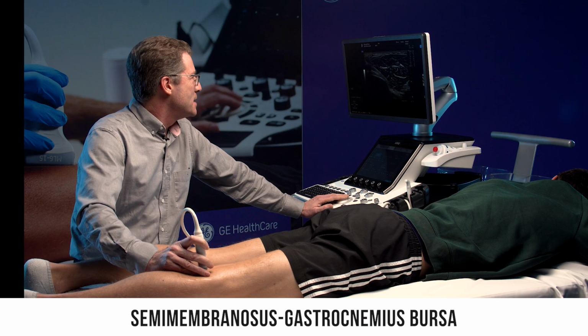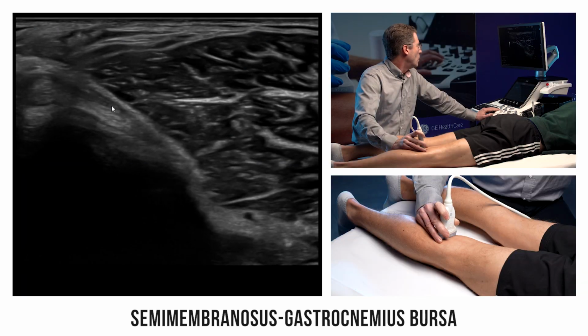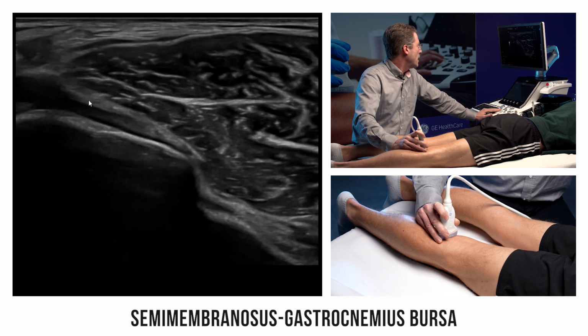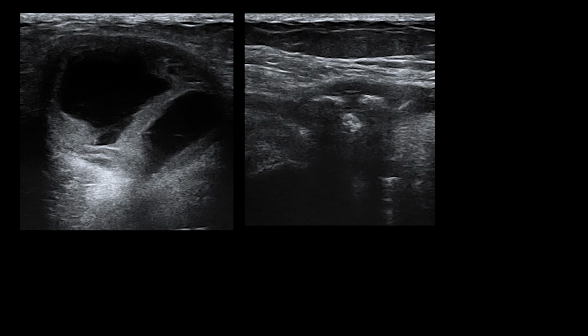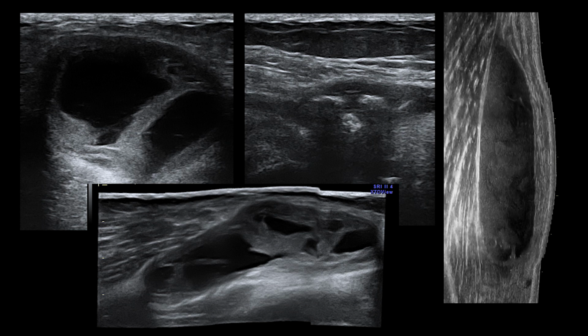We will now analyze the relationship between the medial gastrocnemius and the semimembranosus. Between the two is a small common bursa, which can be the source of popliteal cysts. These popliteal cysts can present differently. They may be compartmentalized, multilobed, contain osteochondromas, but also have thickened walls. Quite often they burst, and the fluid collects under the fascia, either superficially or deeply.